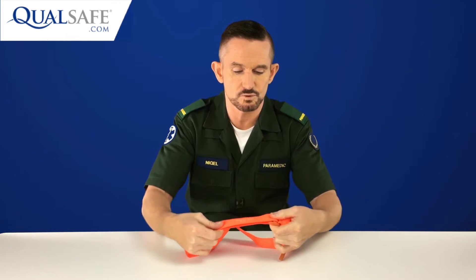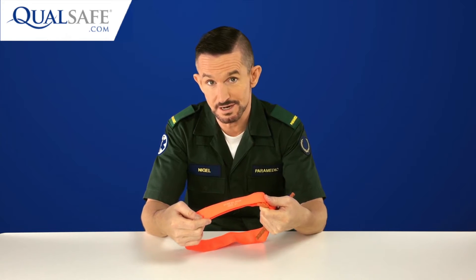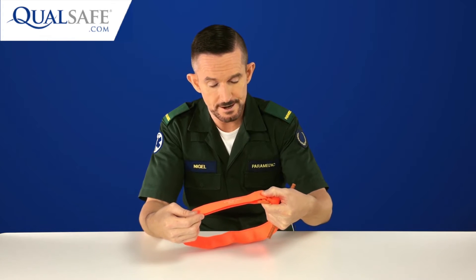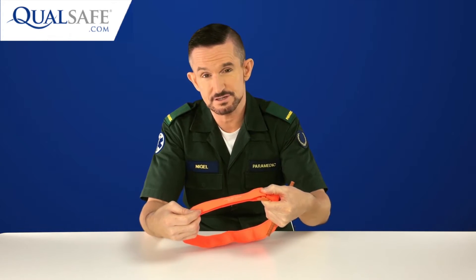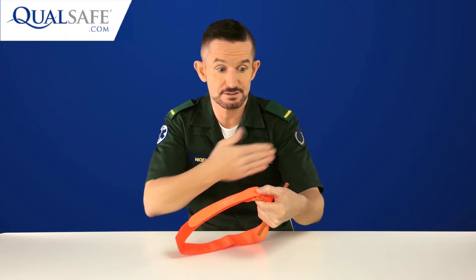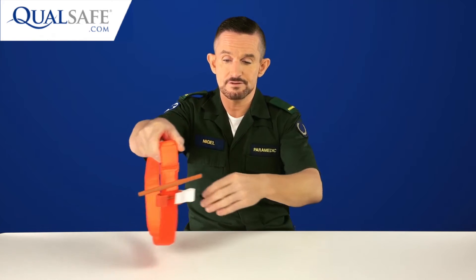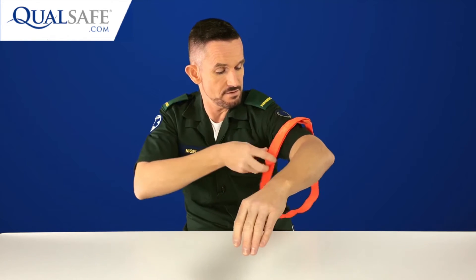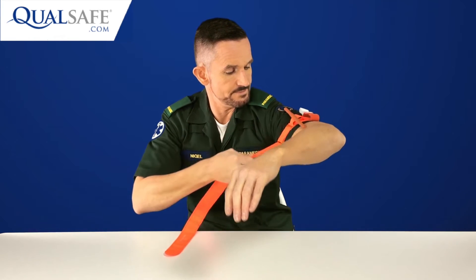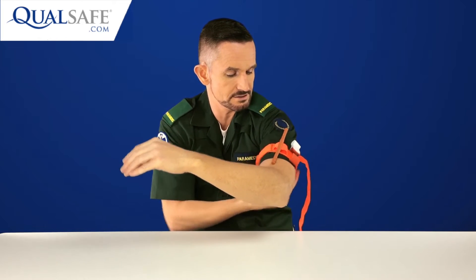There are a couple of reasons for this. One is it's simply one less little task to do in a blind panic when your patient is bleeding out with life-threatening bleeding. But also, this is now ready to be applied single-handedly, in case I'm the casualty and I need to apply it onto one of my arms with only one hand. So it very easily loops over the end of the arm or the leg and you can pull it tight and velcro it around to the back.